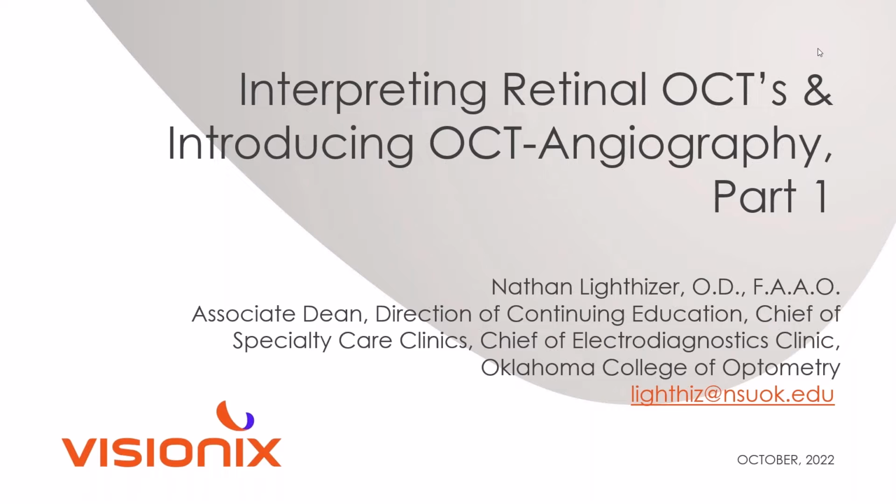I'm sure tonight's lecture is going to be very similar in terms of popularity because this is a very hot topic. And we're going to go further by talking about OCT angiography as well. If you haven't seen this technology work, this should be a great overview. I also want to remind you that this is part one of a two-parter, and we're going to do the other part in November.